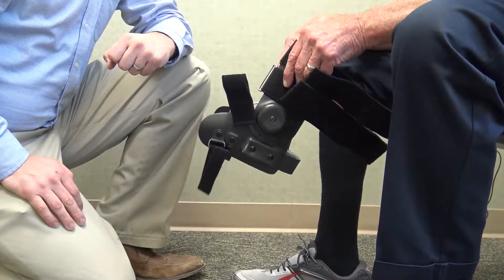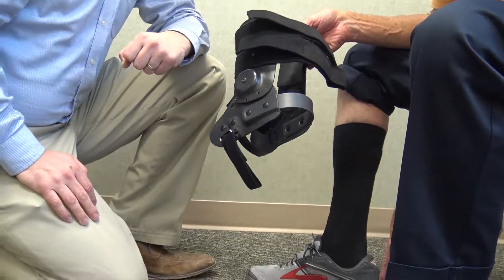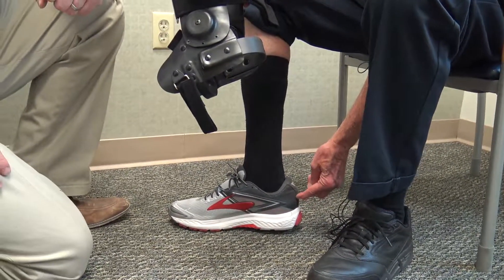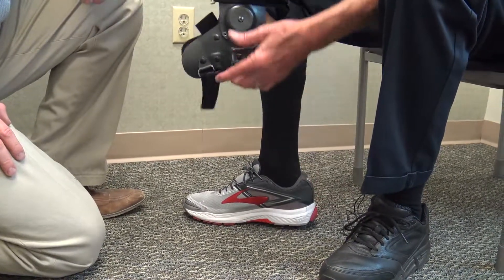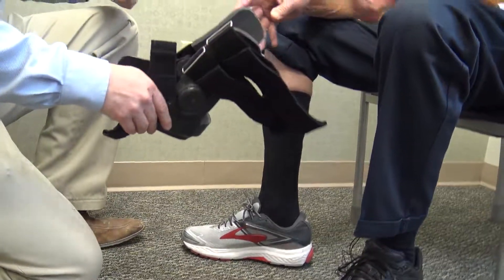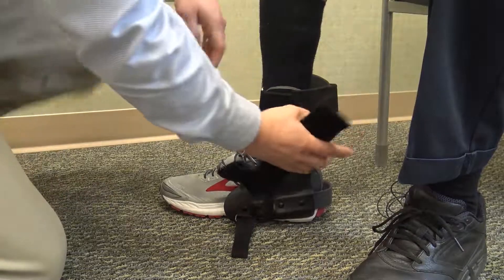This happens to be a right large. The most important thing is to make sure that the brace rides up — it usually rides up about three quarters of an inch or maybe even an inch at the heel counter junction, more or less, right here — not at the foot. And it angles down about 30 degrees that way. The most important thing is to get that posterior heel, and I'll stand up once he gets it on there.